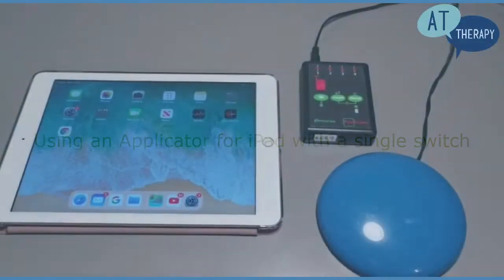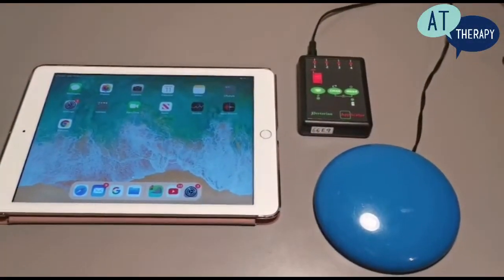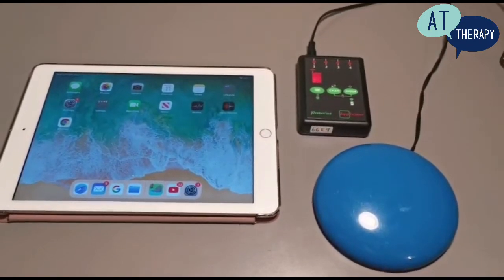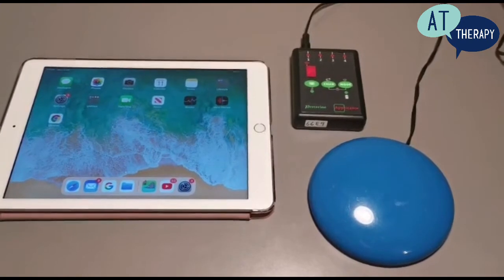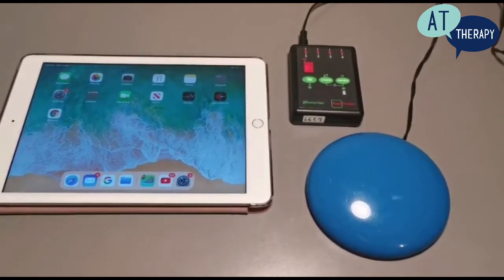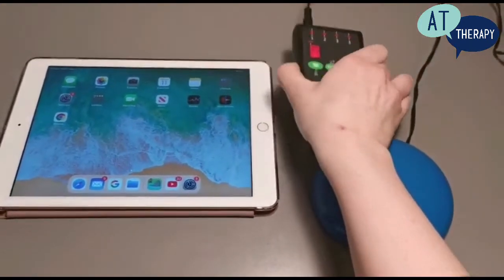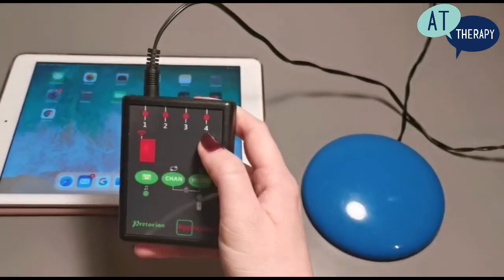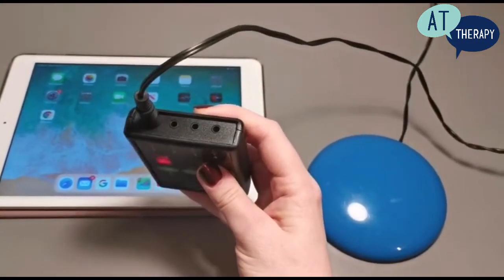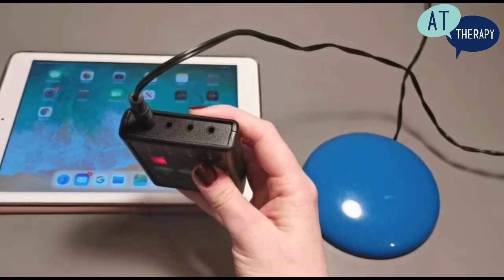Hello, in this video we are going to be having a look at how to connect an applicator to an iPad to enable the use of a single smoothie switch. On the front of the applicator you can see that we have the four numbered switch ports, and in this video we are going to be using the first switch port.